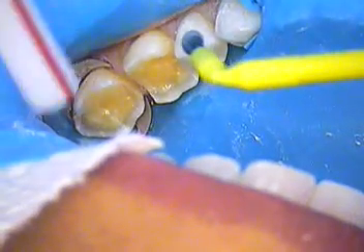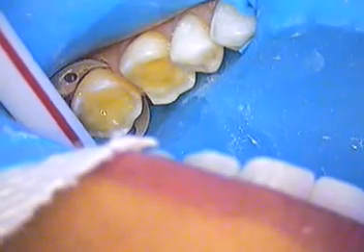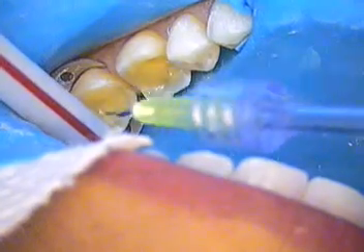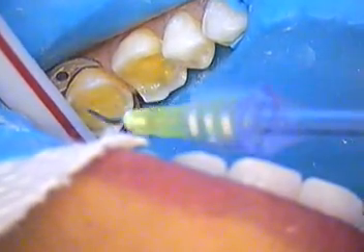The next step is to place the bonding agent — primer first, then bonding agent. This really slams the door on any sensitivity issues. I like to use a syringe that has absolutely no water going to it — we designate this one as air only. All I'm doing is just thinning it down so it doesn't get too thick. We mark this particular air-water syringe so we know it's designated air only — push both buttons and no water comes out. We're going to light cure that and then add our composite.